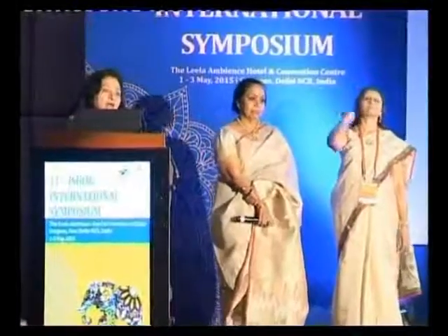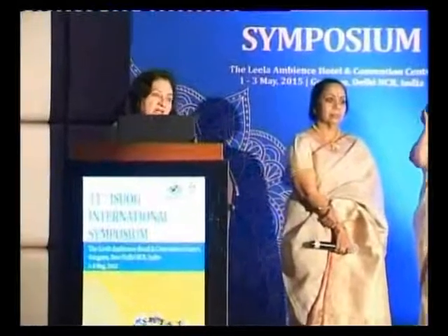Sonal, can I add something here? Yeah, please. What I would say is that if you are beginning to learn color Doppler, then follow the cycle. Because when you follow the cycle, you will know what changes are happening on a day-to-day basis. So we normally say, do it on day 2, do it on day 6. When you look at the endometrium and the follicle with color Doppler, you'll see slowly that the blood flow is increasing. The peak systolic velocity is increasing, and the diastolic is also increasing. So when you watch that, you'll understand yourself.